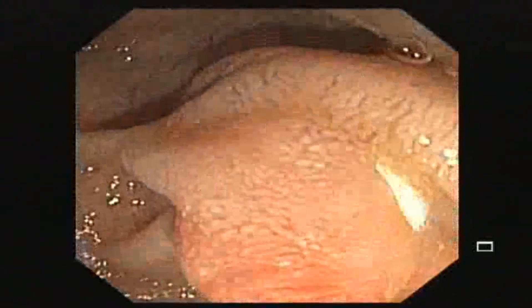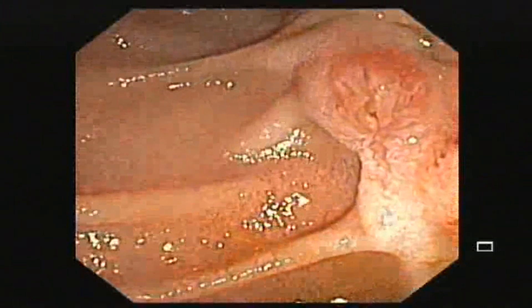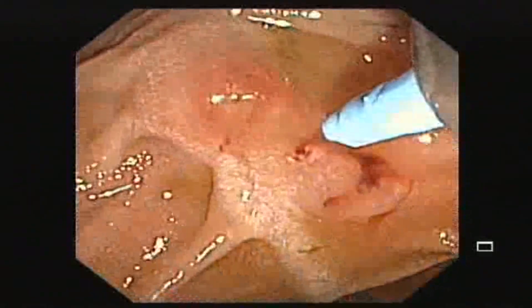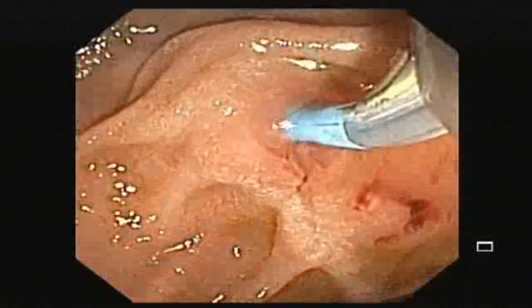This is the ampulla, and we are going to cannulate the bile duct. This is the papillotomy knife, and we are trying to cannulate the common bile duct.